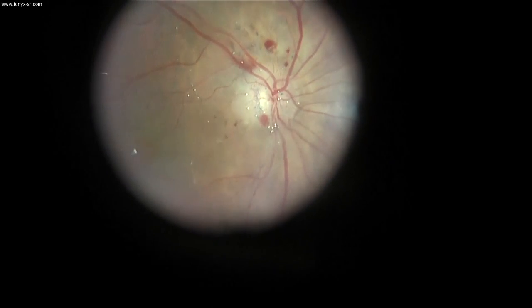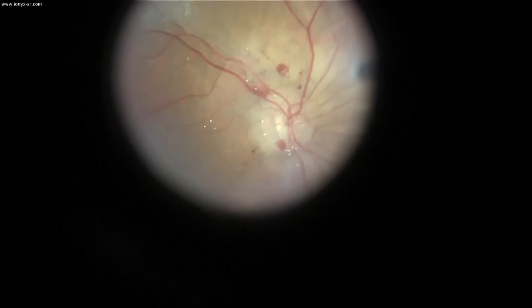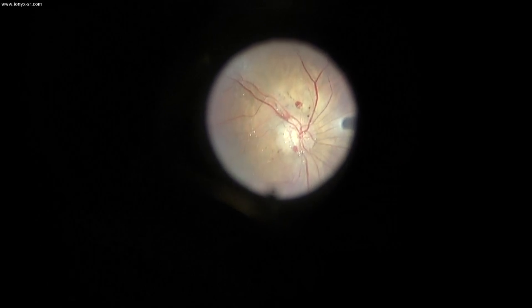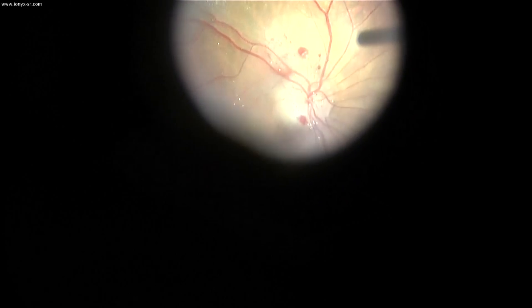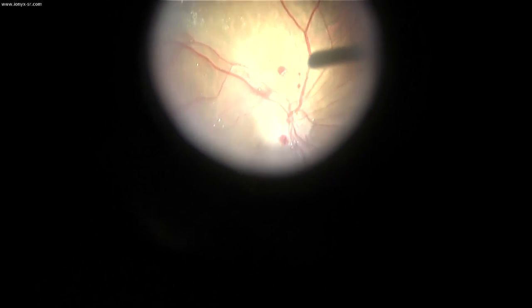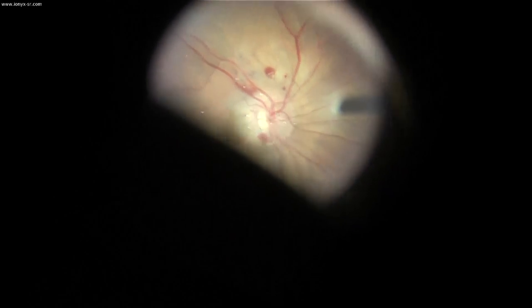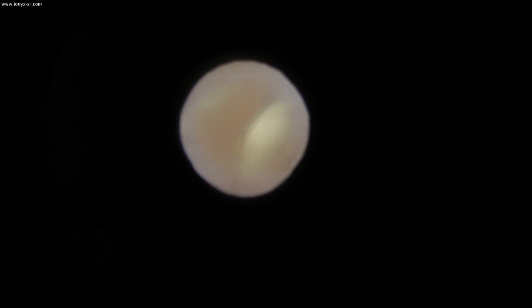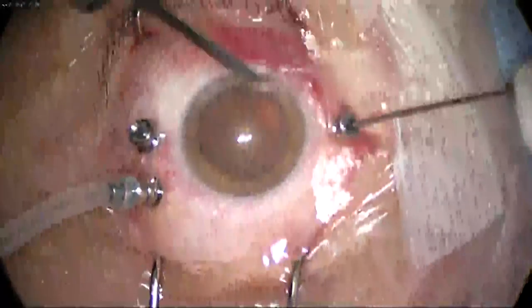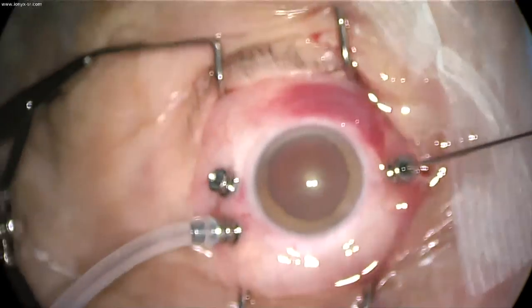So if I understood correctly, he said to stop, right? Yes, now you can leave the eye at around 5 or 6 as a hypotony, and in a day or two it will be perfect. I am now without infusion. Fantastically opened. Thank you so much. I will send you the results in the next weeks, okay? Fantastic, please do. You've been great to call me. It's been a fantastic experience. Thank you, Barbara. Bye-bye.